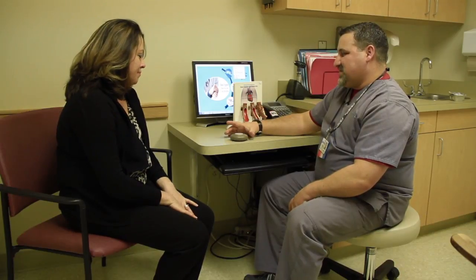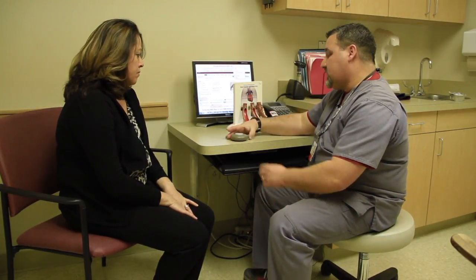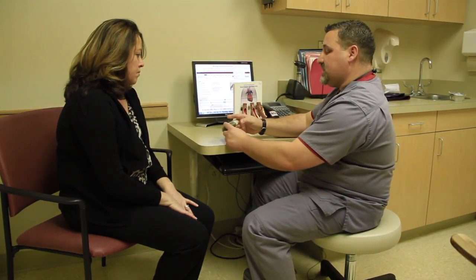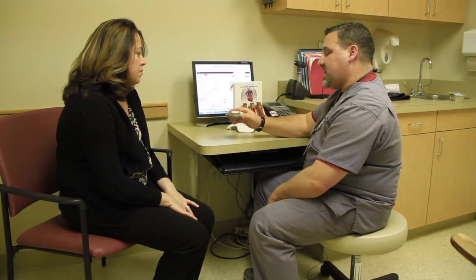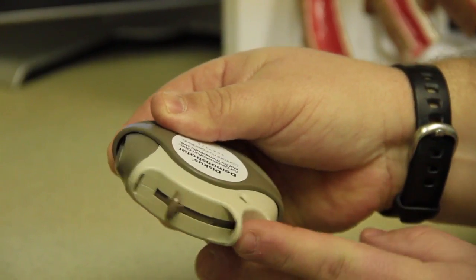Your prescriber has ordered a Diskus for you to use, and I'm going to go over the proper steps to do so. When you get your device out of the box, there is a little indentation here where you can put your thumb, and this portion is a lid that you're going to slide back to expose the mouthpiece. We'll just slide that back, and you will hear a little click.